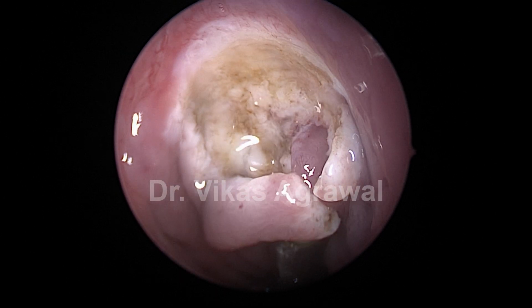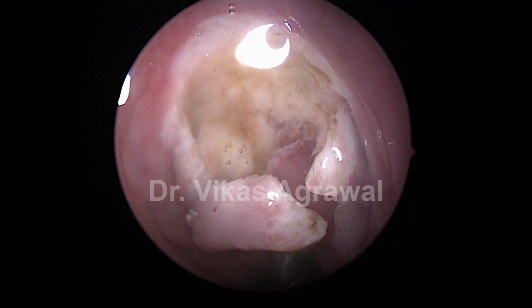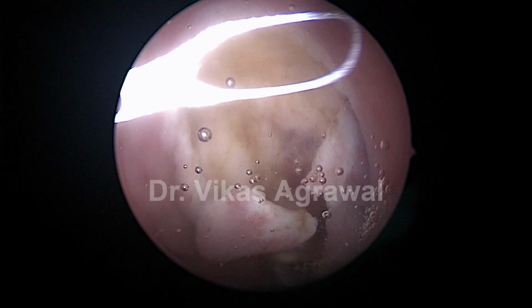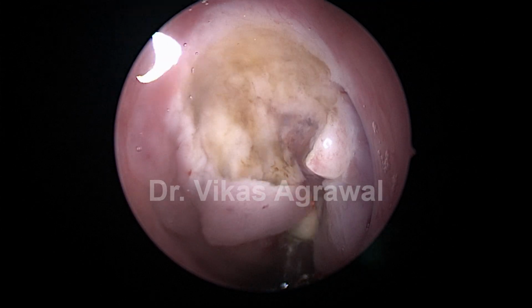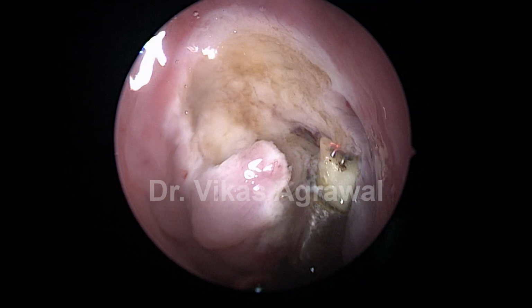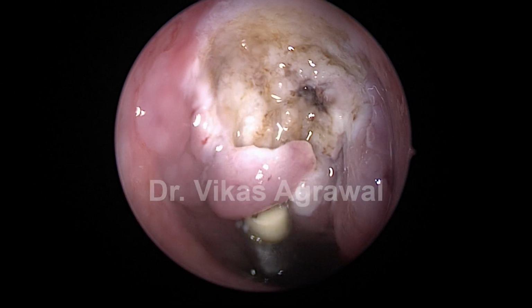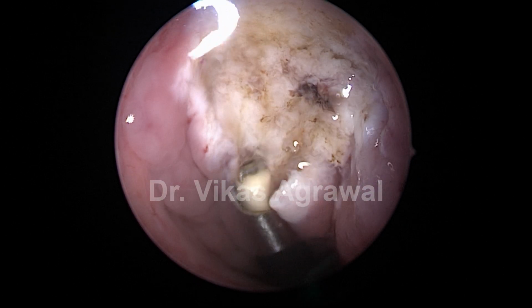We have already performed tonsillectomy for this child. Tonsils were also grade 4. So these are the cases where the result of surgery is very, very gratifying, because on the same day of surgery, the child will start breathing from his nose and his sleep apnea will simply vanish.